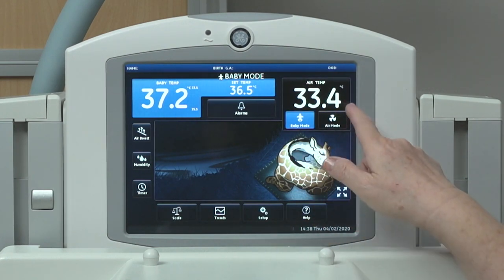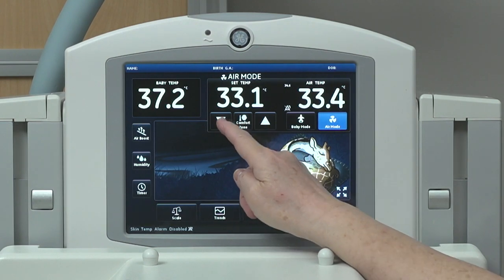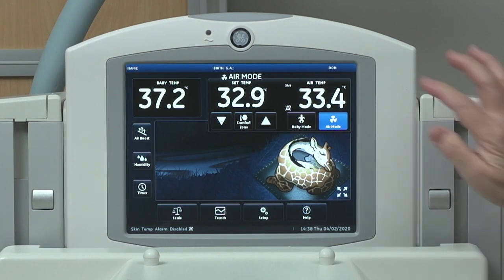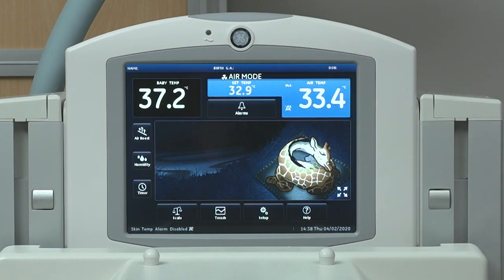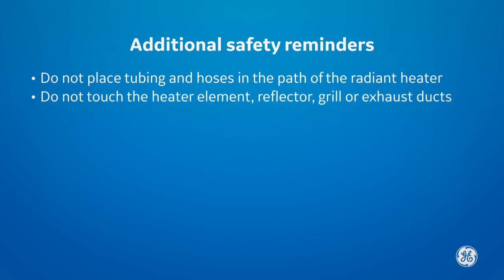Alternatively, place the bed in air mode and adjust the temperature as needed to meet the desired temperature per independent measurement such as axilla or rectum. However, baby mode should be used whenever possible. Do not place tubing or hoses in the path of the radiant heater, and do not touch the heater element, reflector grill, or exhaust duct on the back of your bed.